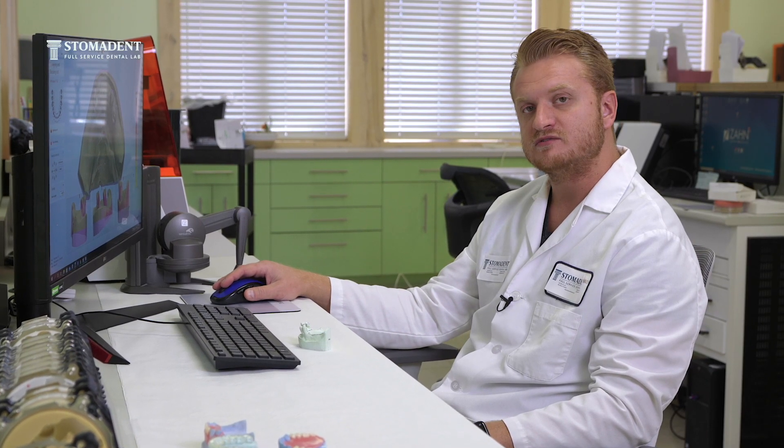The beauty of making digital removable partial dentures is that the consistency is always there. Whether you're designing on Three Shape or Exocad, the designs always come out to be flawless and accurate.